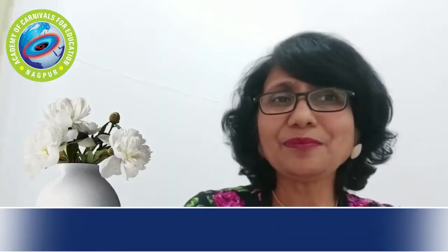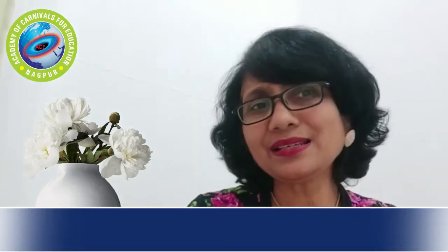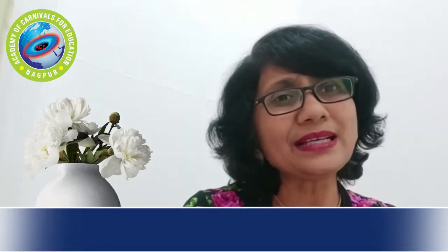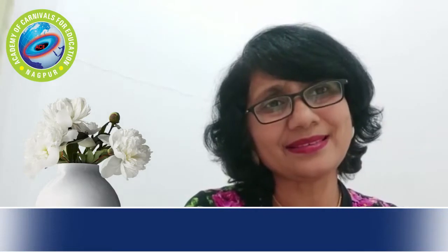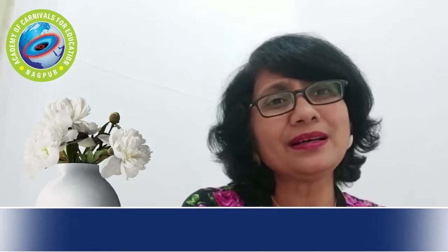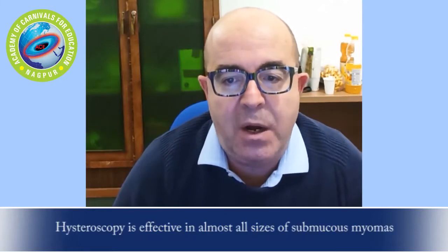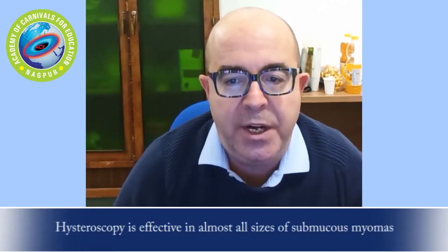Okay, submucous myoma of G0, 1, 2 can be managed with hysteroscopy. But size of the myoma also matters. Can you please tell us what size of myoma can be dealt with hysteroscopy? Second question, which size of myoma can be dealt with hysteroscopy?